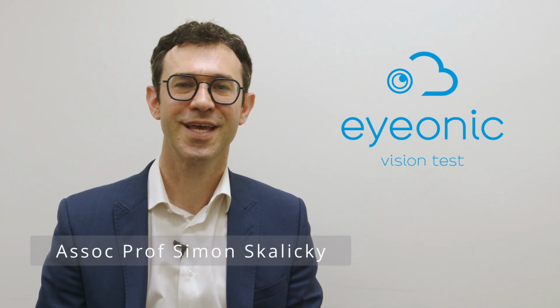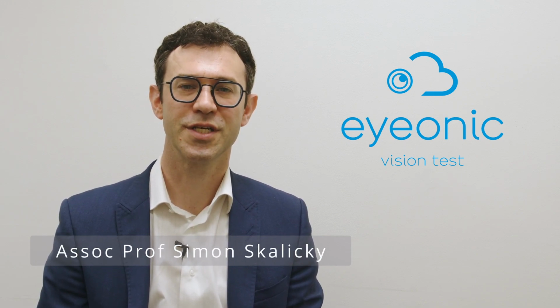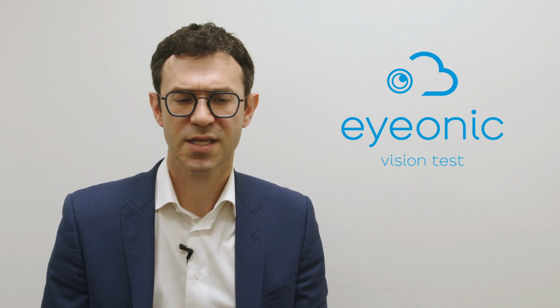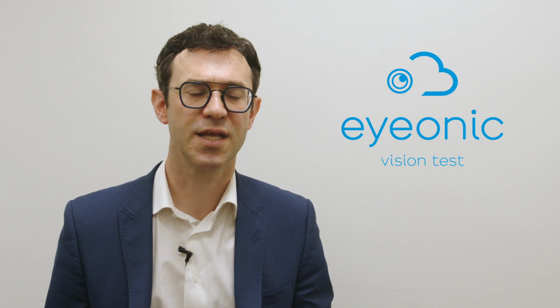Visual field testing is a critical part of modern optometry and ophthalmology care, and it is an assessment of a person's peripheral vision. Now, with today's technology, most visual field testing involves large, bulky machines in clinic, and these have some limitations. They're not portable, and often patients don't enjoy performing visual field testing on these machines. They might find it uncomfortable to put their head in, it might be sore on their neck or their back.